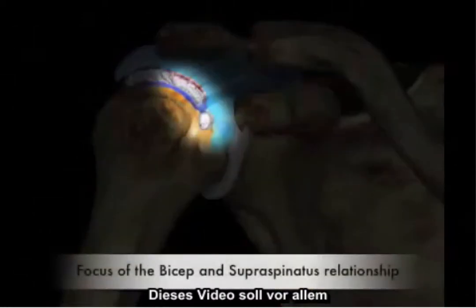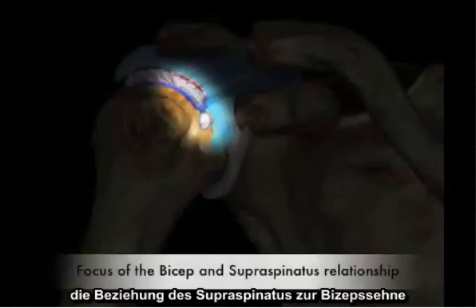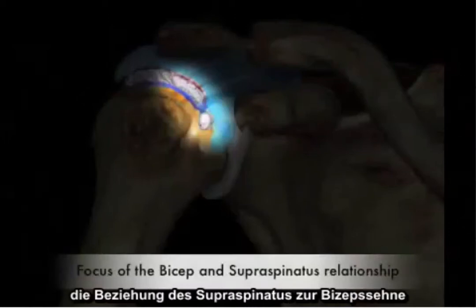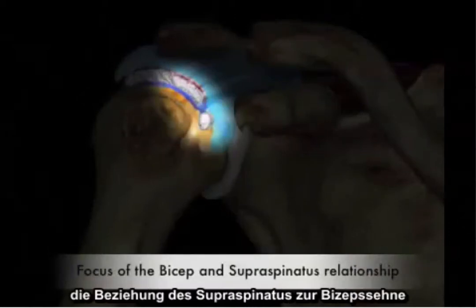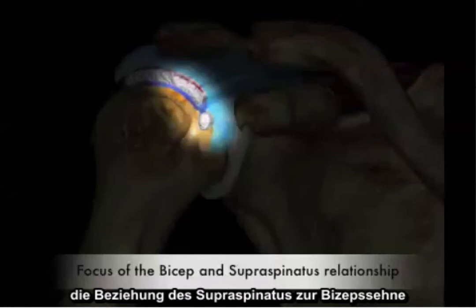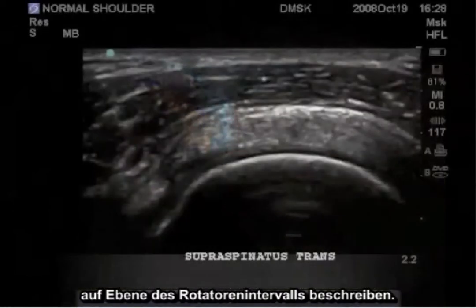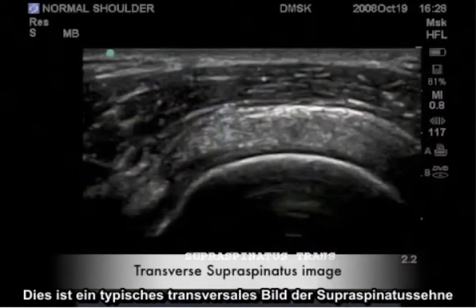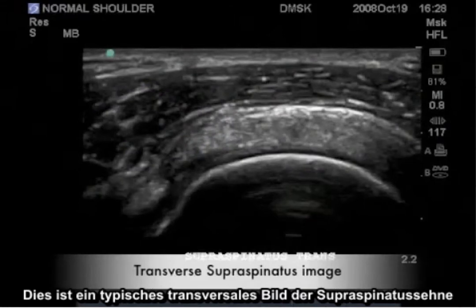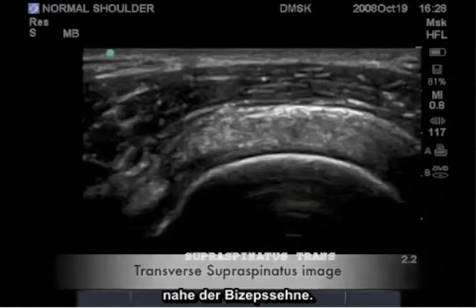The main emphasis of this video will be to describe the relationship of the supraspinatus and bicep tendon at the level of the rotator interval. This is a typical transverse image of the supraspinatus tendon resting near the bicep tendon.